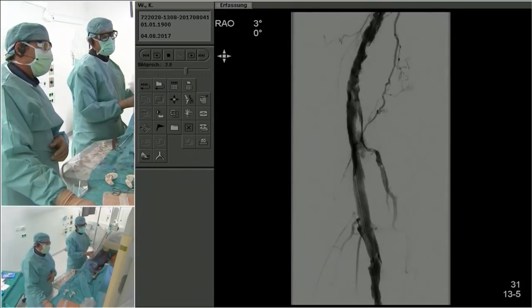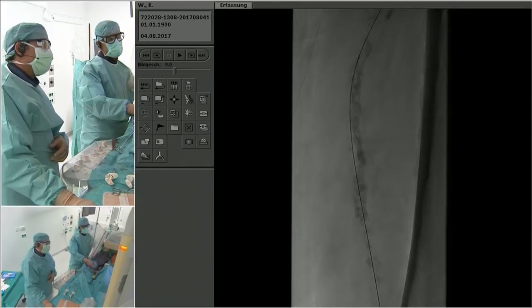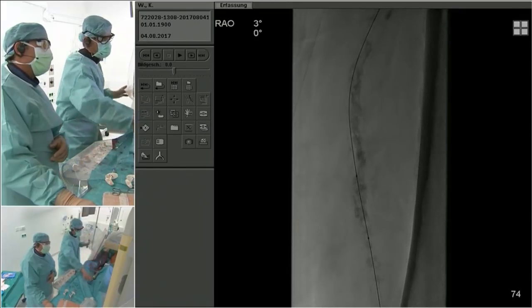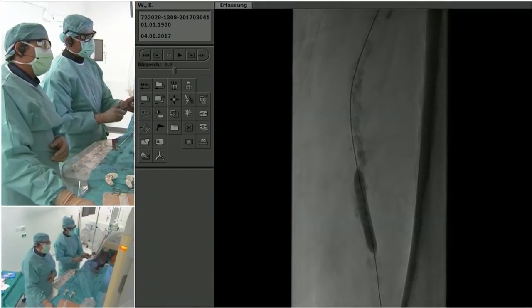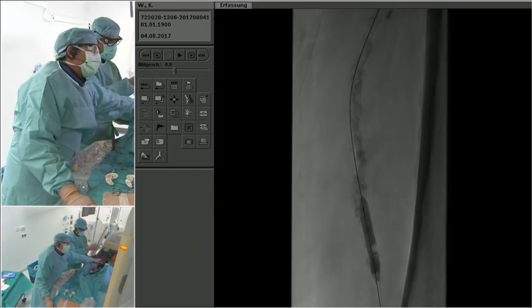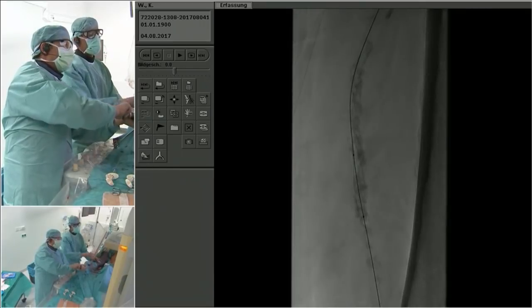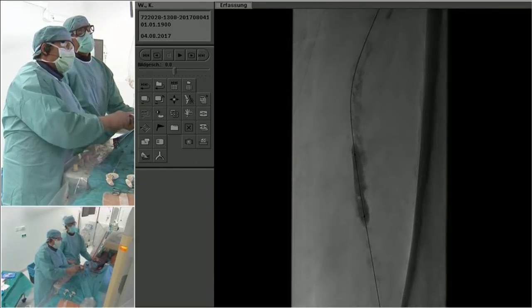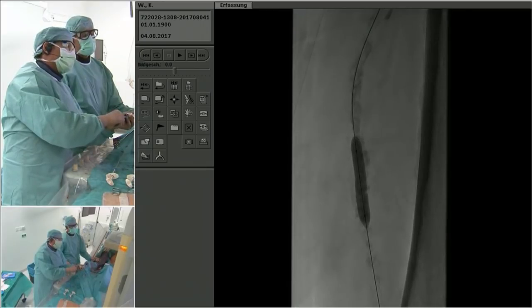I think we still need some more aggressive ballooning here. What size was that last balloon, Andrej? Actually, maybe 6/40, semi-compliant. So it was with 16 atmospheres, probably 6.5 millimeter in diameter. The question is, shall we implant here a 6.5 Supera or only a 5?